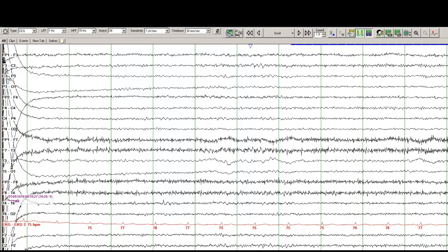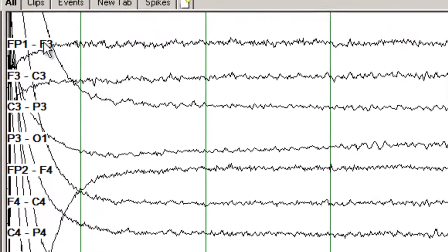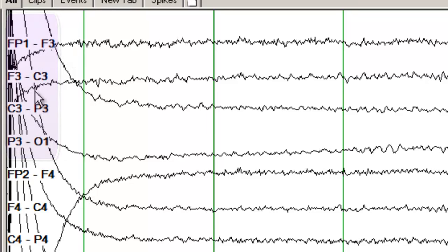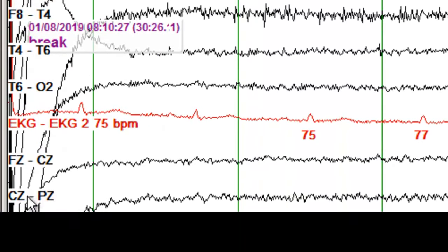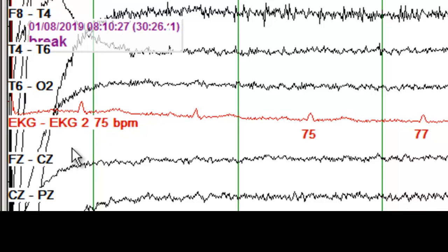If you go to the very left side of this page and follow this cursor, the alphabets that end with an odd number are recording electrical activity from the left side of the brain. The channels that end with an even number are recording electrical activity from the right side of the brain. And if you go to the last two channels at the very bottom of this screen, these are channels ending with the letters CZ and PZ — channels that are recording activity from the midline.